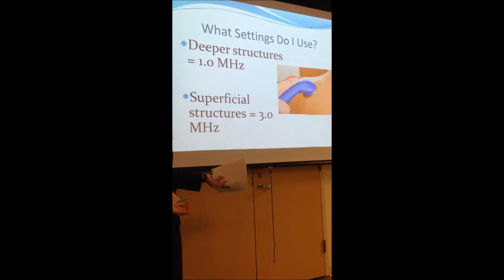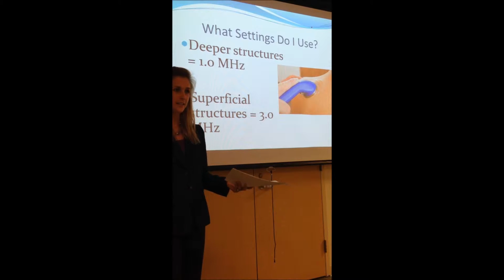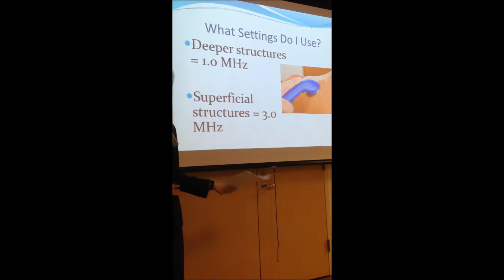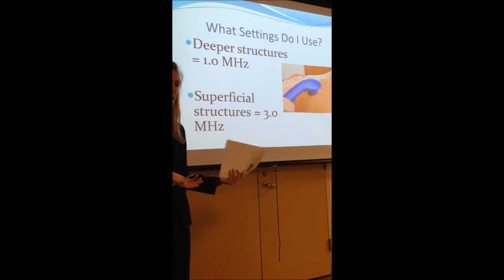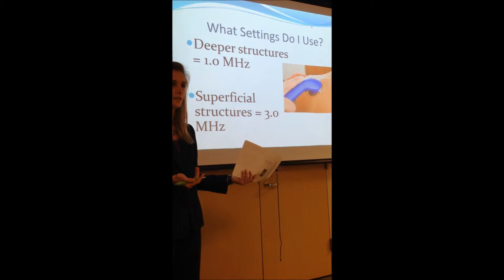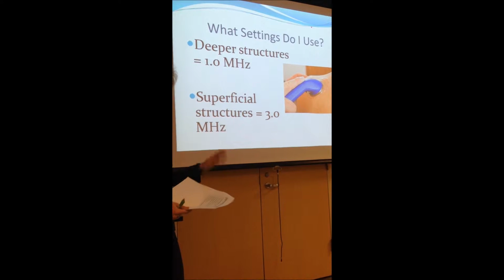So what settings do we use? PTs will write down the settings in their plan of care and PTAs will carry it out. But if you get a patient who asks you a question about this, we all need to be on the same page and understand why we're choosing the settings that we are choosing. Generally, deeper structures are 1 megahertz, and more superficial structures will be 3 megahertz.